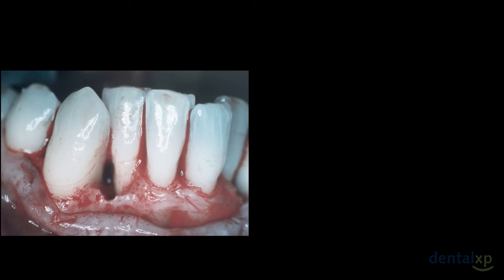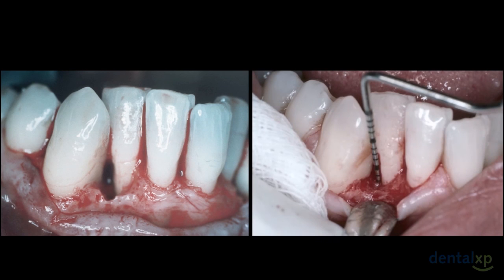This patient was treated approximately 10 to 12 years ago. The defect between tooth number 26 and 27 approached 8 to 10 millimeters again, and there was no bone or very little bone on the mesial of 27 and distal of 26. This was a two-walled defect. We used Emdogain as well as freeze-dried demineralized bone. Upon reflection of the flap a year later, I found there to be what appeared to be bone and virtually no probing.